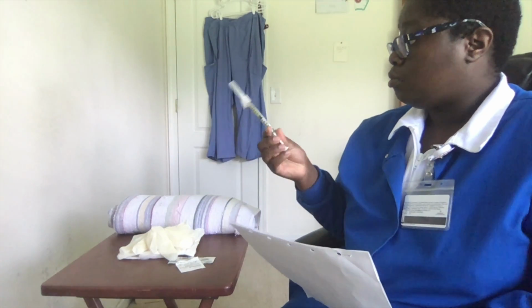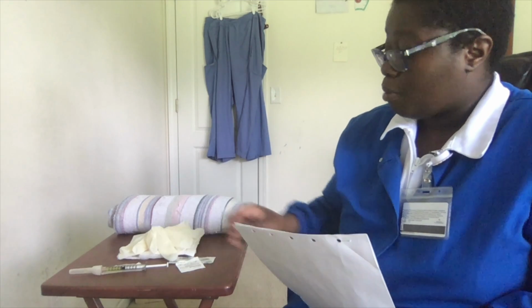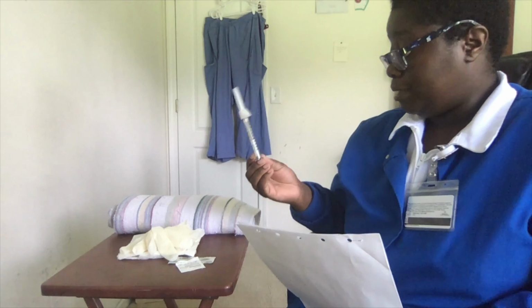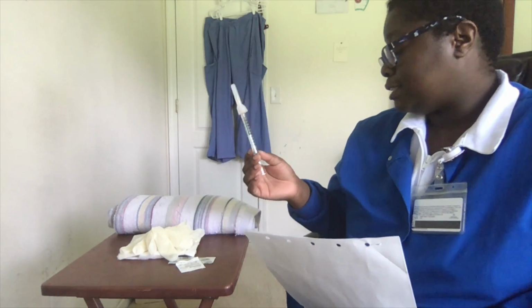And B12 subcutaneous, which is what's in this injection, and subcutaneous because that's a type of injection. 0.5 milliliter because the doctor wants 500 micrograms to be given to you. And a month has passed. So it's time for your next shot.